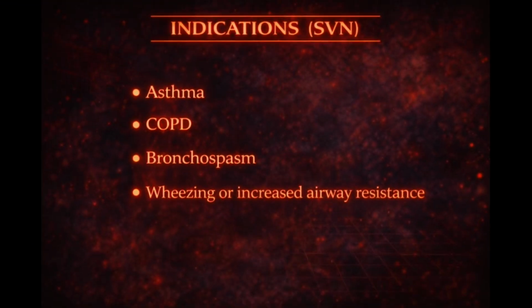Indications for SVN therapy include patients who require inhaled medications to improve airway function. These include patients with asthma, COPD, bronchospasm, wheezing, or increased airway resistance. The goal of SVN therapy is to deliver medication deep into the lungs, reduce bronchospasm, and improve airflow.